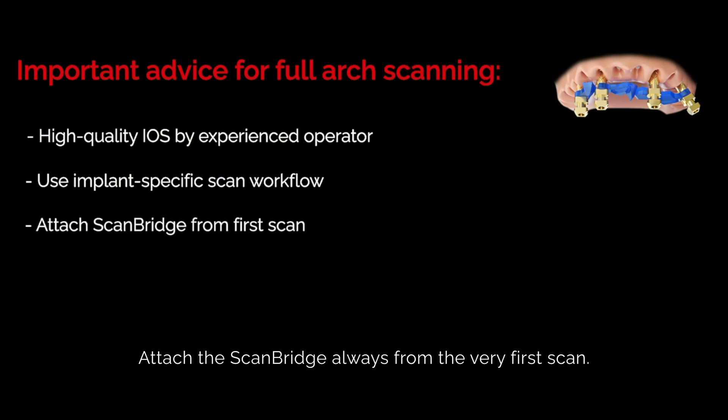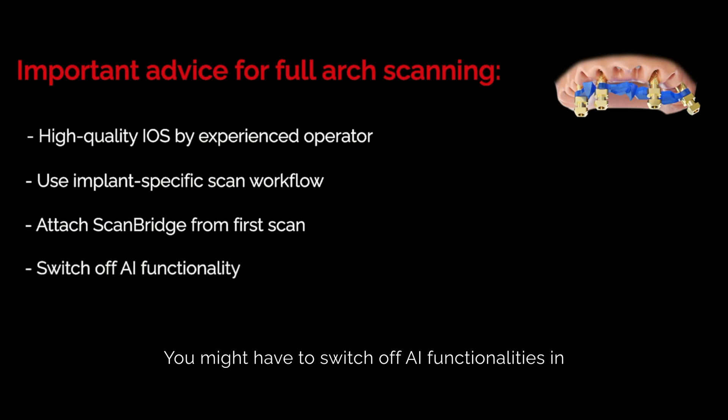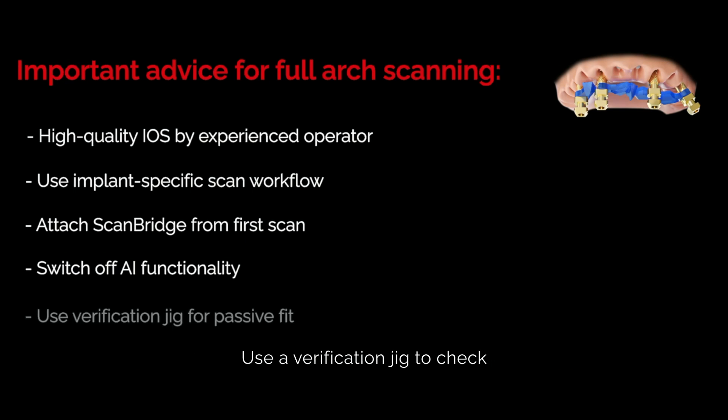Attach the scan bridge always from the very first scan, as this first scan defines the accuracy of the full arch. You might have to switch off AI functionalities in case the scanner automatically removes the scan bridge.